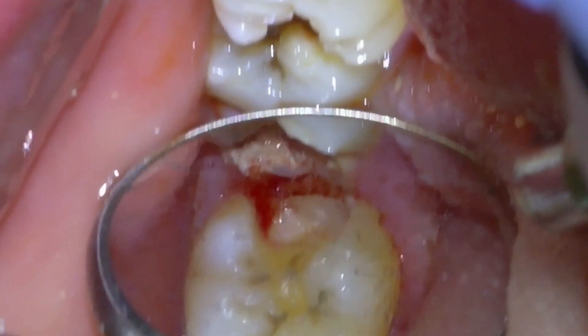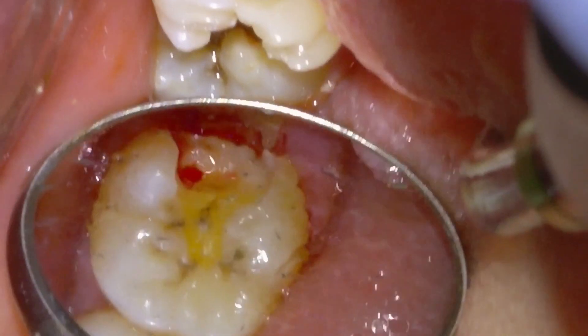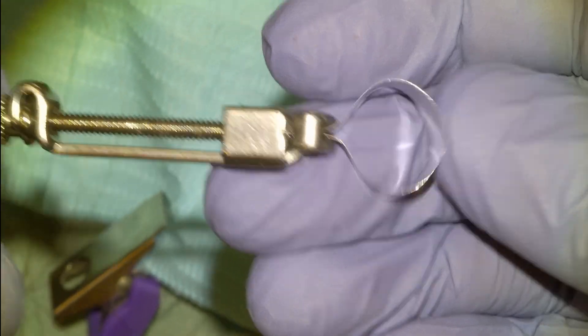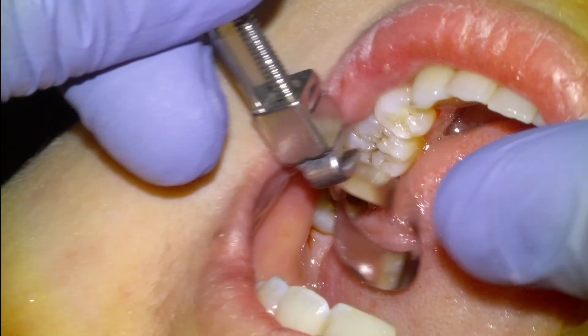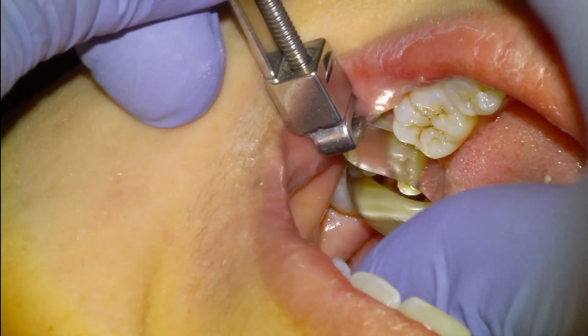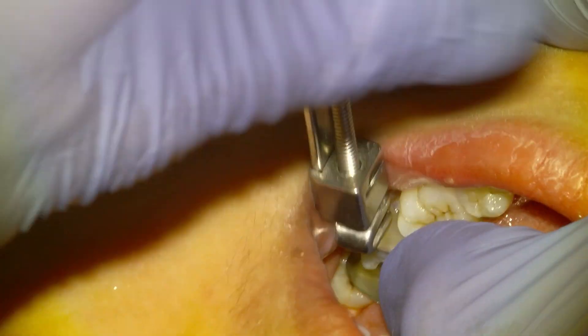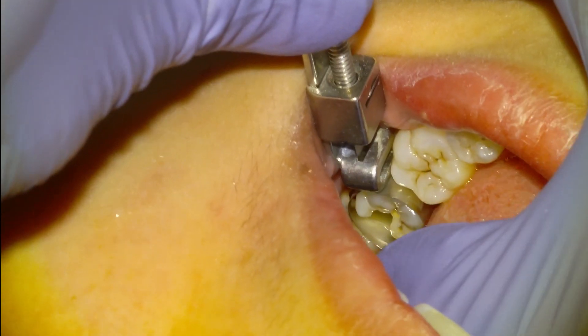We're mostly satisfied here. Sometimes I'll forego getting too deep to the pulp to prevent a pulp exposure. I'm going to use a Toffelmyer to matrix the distal surface of the tooth, cinch it down, and we're going to use Equia Forte in this case.